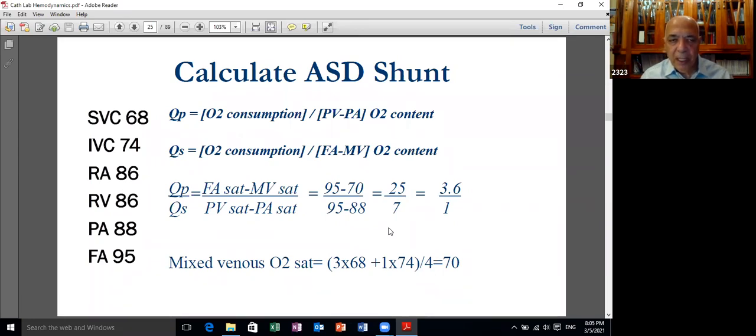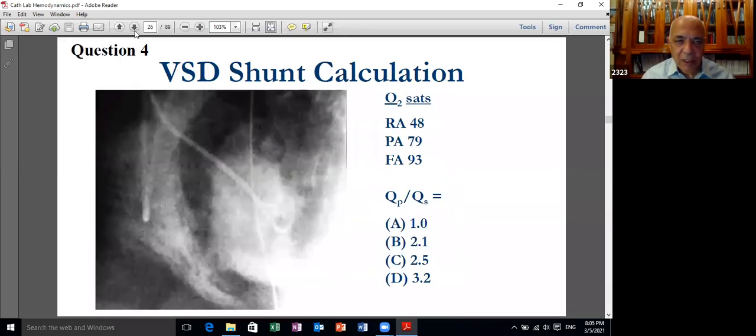One of them is if you have a borderline case or you have a discrepancy between the clinical findings and the non-invasive findings. So as you see, there is a huge number of indications for cardiac catheterization. Even in acquired conditions, this is a ruptured ventricular septum in a patient with ventricular septal defect with an acute myocardial infarction. Here is the left ventricle posteriorly located, the right ventricle anteriorly located, and the shunt. Actually, we don't calculate the shunt in these conditions because we know these people are very sick.